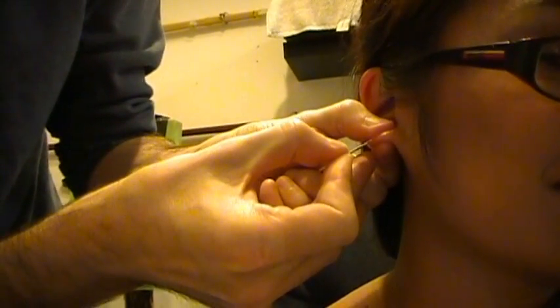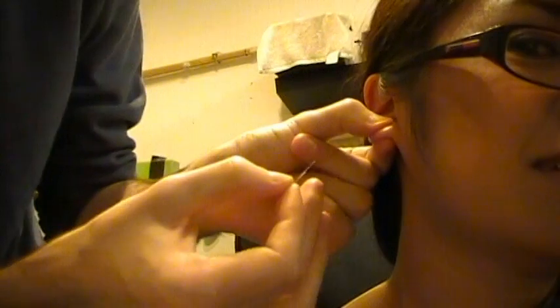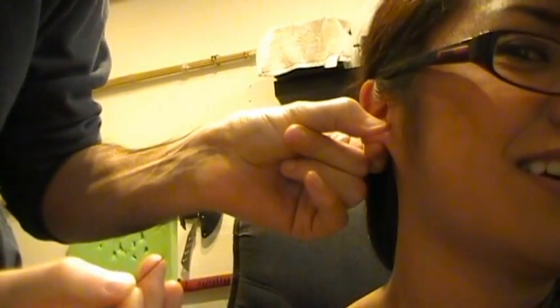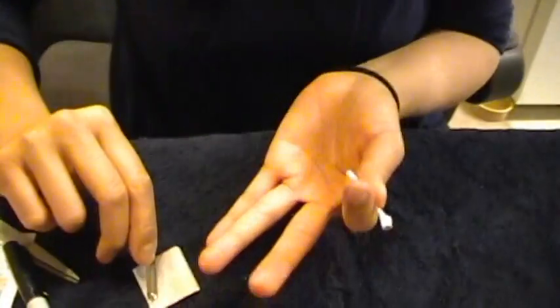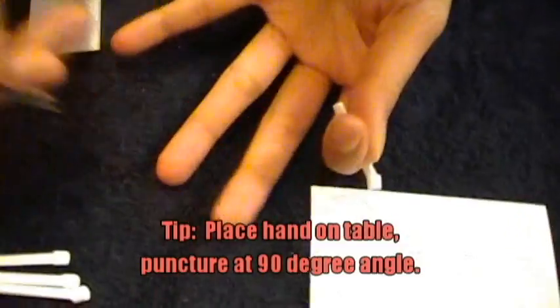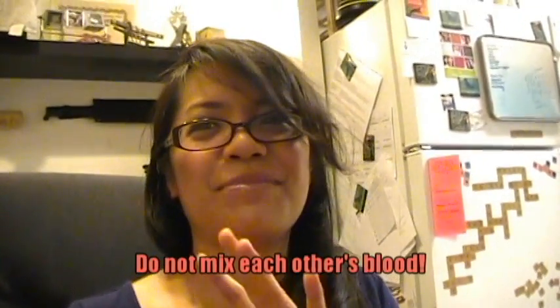You ready? Yeah. Oh, that didn't hurt. Yeah, and I'm not getting any blood out of it. Well, you will. What's wrong with the earlobe? There's nothing coming out. Oh, maybe I drank too much coffee. Are you doing it again? Yeah — no, that's not too bad. It just kind of feels like... but there's no blood coming out. You stuck me twice in the ear. Now you're going to stick me in the finger? You're going to stick yourself in the finger. This is like masochist torture right here. Oh God, I can't do it. There you go, that's some blood. I can't squeeze it, can you help me squeeze it? Is that why you've been so nice to me, because you knew you were going to make me bleed this weekend? I don't care. You want to mix blood so we're like blood brothers — sisters. I don't want Hep C. Just make sure this goes down first so it won't get into the other ones.